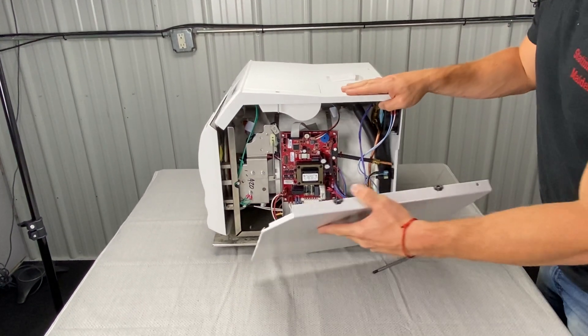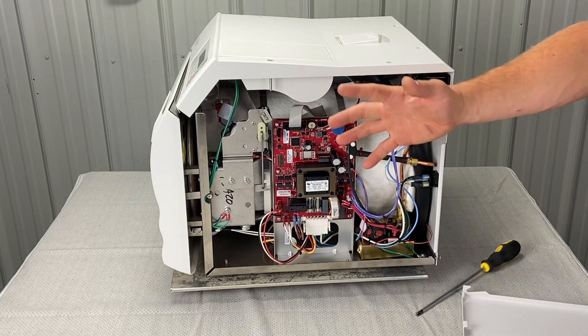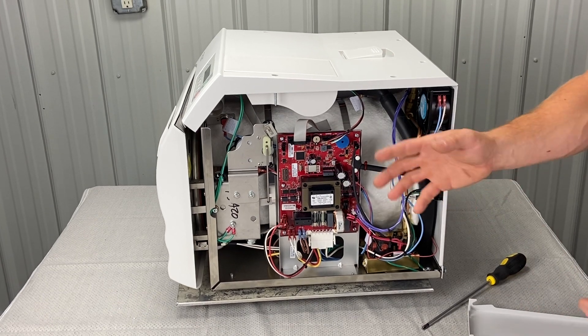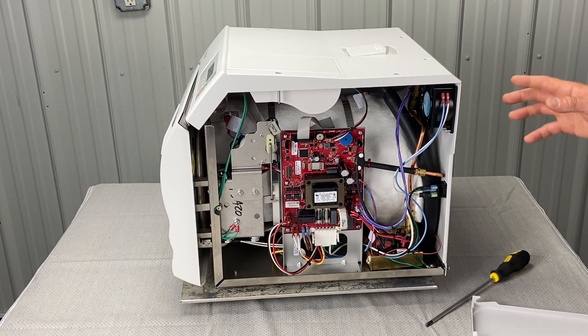There are two tabs here that interlock at the bottom, and then you rise it up. Now the right side panel is off. Now we can inspect for leaks, test components, go into service mode if we have to — we can do any number of things.